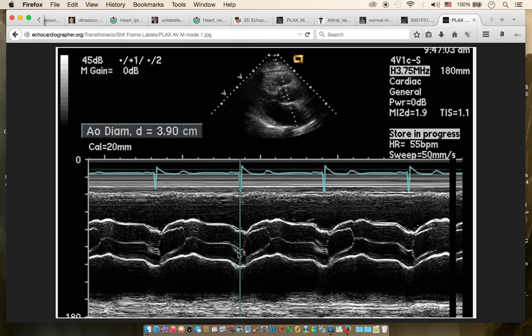When you have a problem, for example, if you see, this is a line here, and if you just have a funnel-like shape, that means the patient may have a problem with ejection fraction, or with the function of the left ventricle.